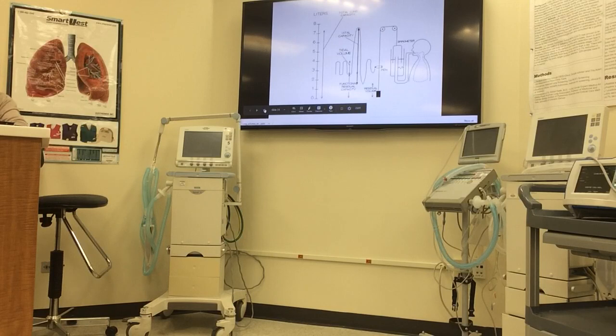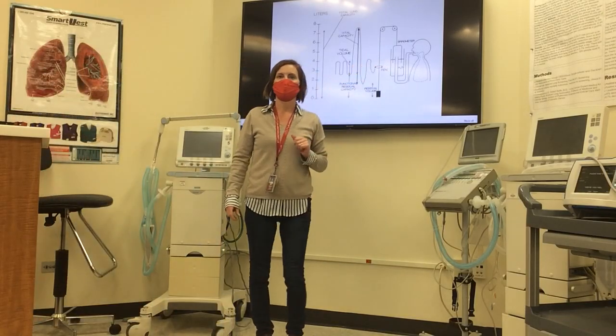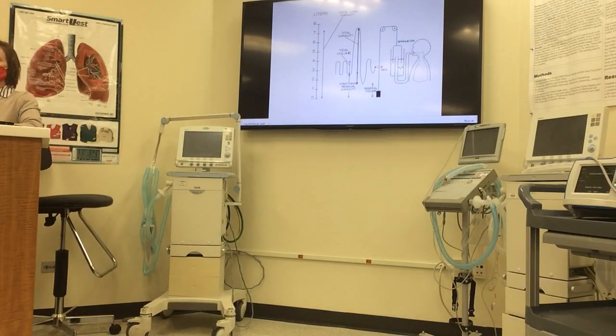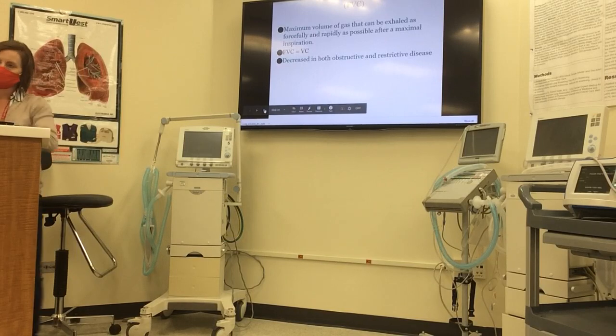Okay, here's another picture of that. So originally the spirometers were really looking at volume displacement, and they had very simple basic spirometers that, based on a little bellows system, would literally graph it out. Now we have really cool machines that we'll take a look at here.